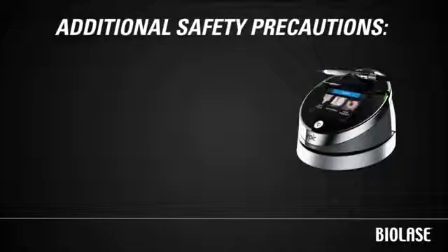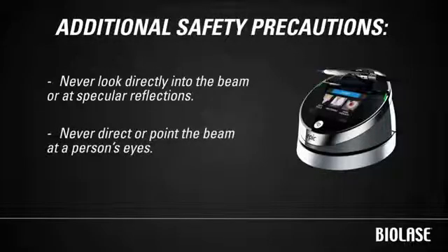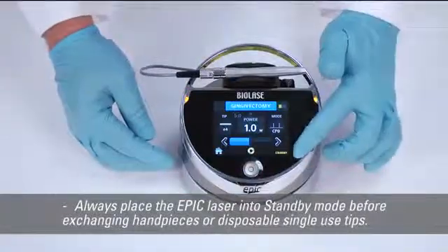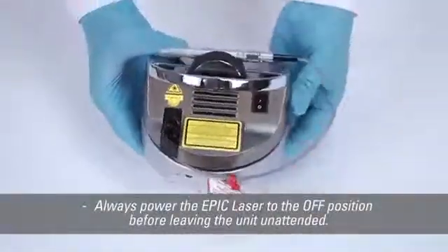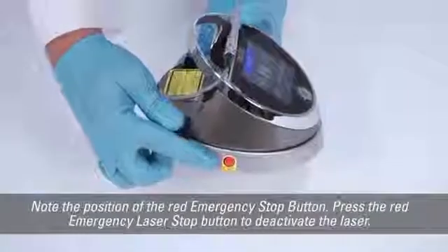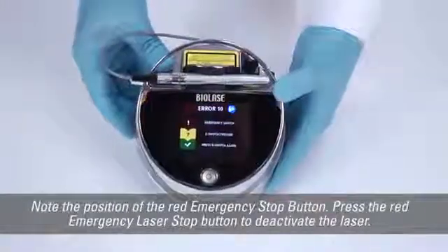There are several additional safety precautions to be aware of. Never look directly into the beam or at specular reflections, and never direct or point the beam at a person's eyes. Always place the EPIC laser into standby mode before exchanging handpieces or disposable single-use tips. Always power the EPIC laser to the off position before leaving the unit unattended. Regulations state that any room where the EPIC laser is used must be marked with an appropriate laser danger sign. Finally, if you need to shut off EPIC in an emergency, press the red emergency laser stop button to deactivate the laser.